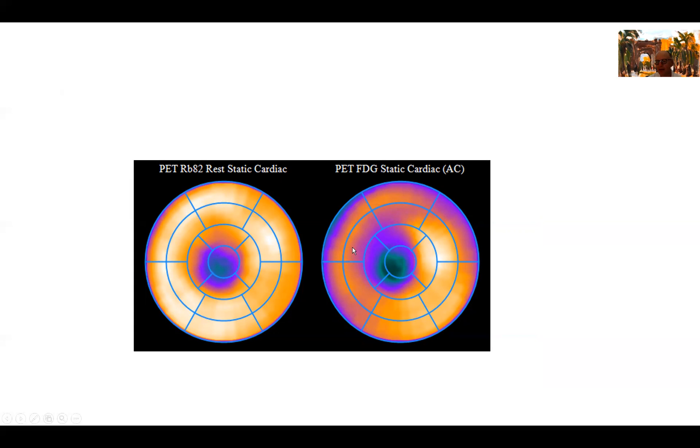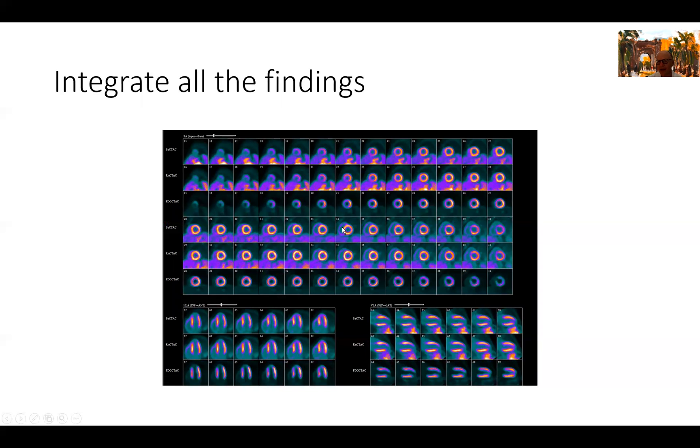Now the rest of the segments, the FDG is not very helpful in a metabolic study done for hibernation because usually you can see variable FDG uptake. The only area we can comment about is the area where we have a defect on the rest images. This is different in cases where we're looking for inflammation or sarcoid, for example.